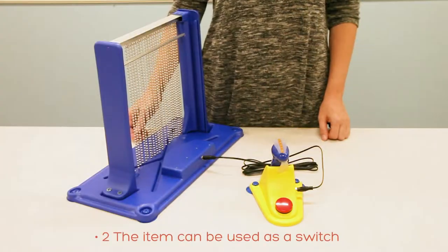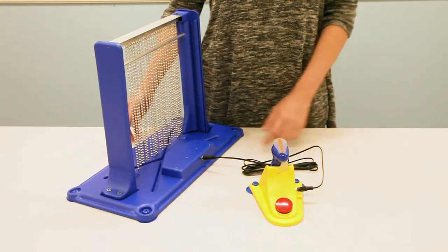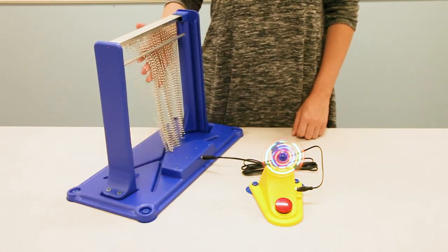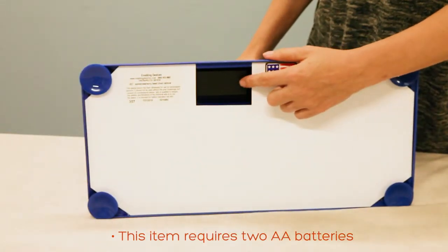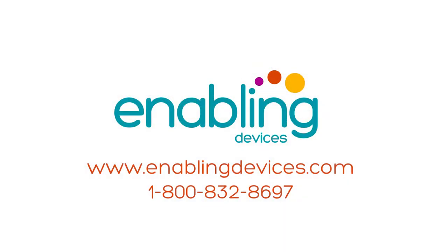The item can also be used as a switch by connecting any adapted item to the jack located in the back. This item requires two double-A alkaline batteries located under the unit. You can purchase these items on our website.